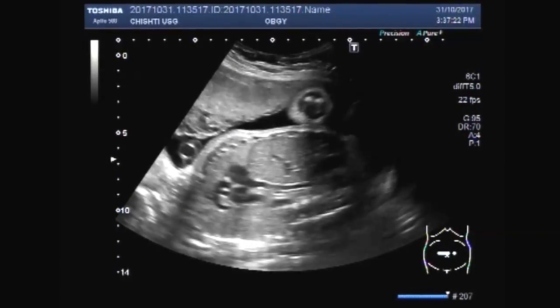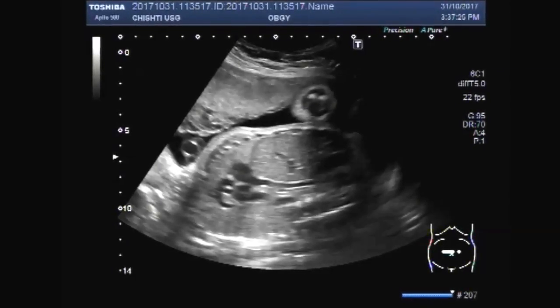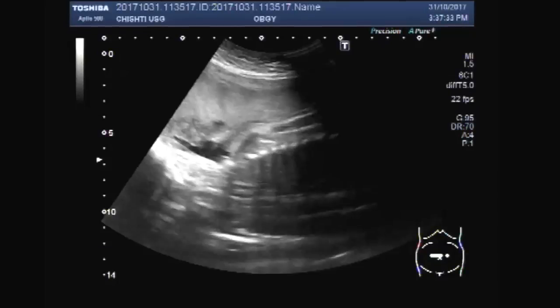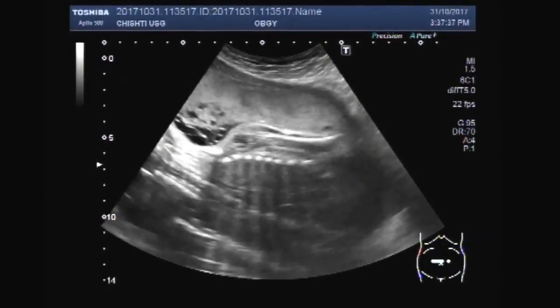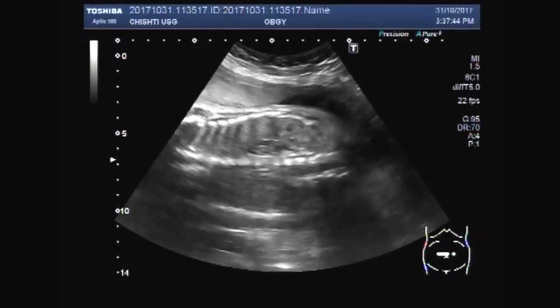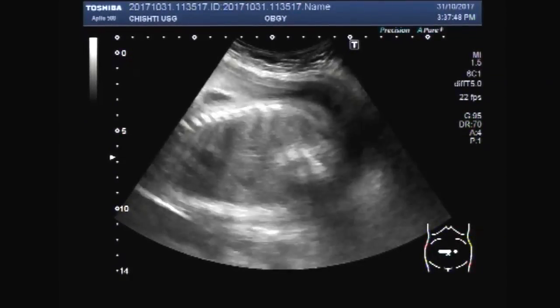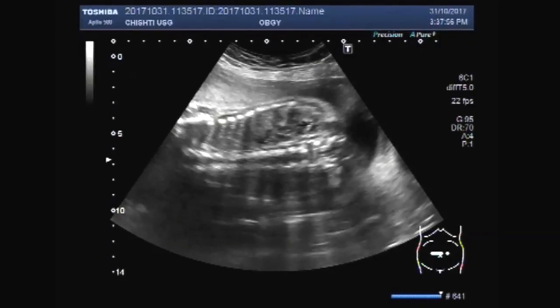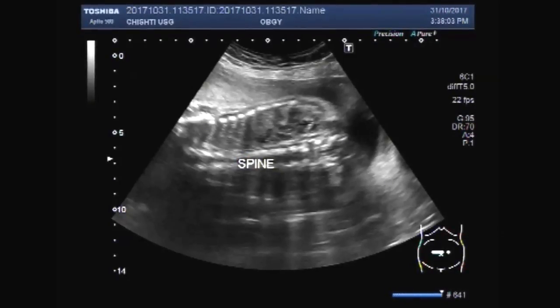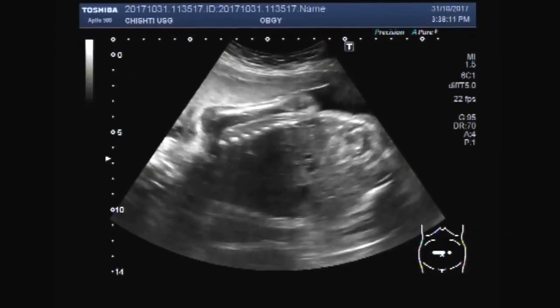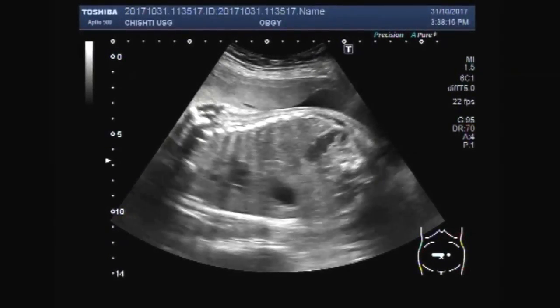You can see the feet and heart. Now you are going to see the spine. This is the spine of the fetus.